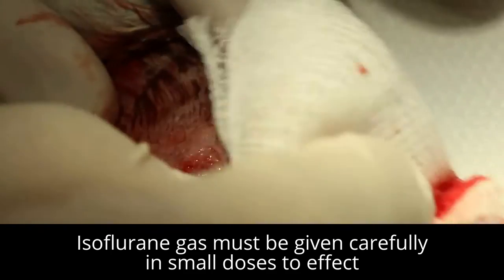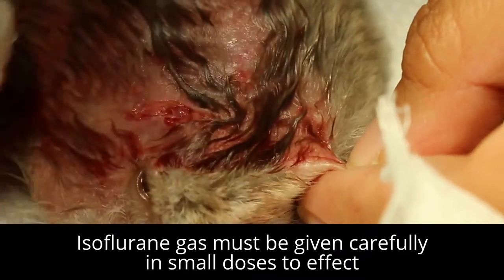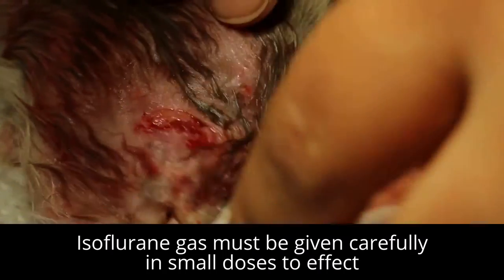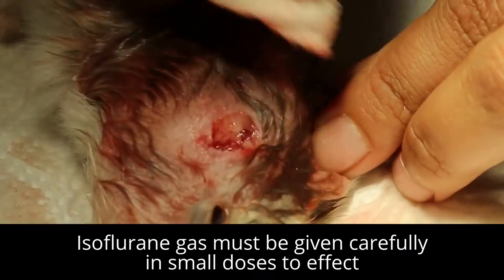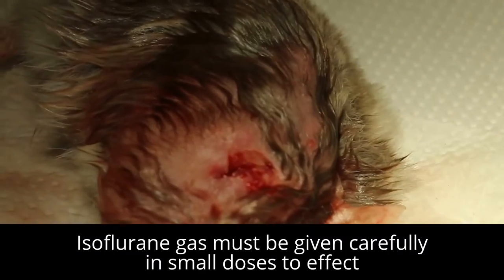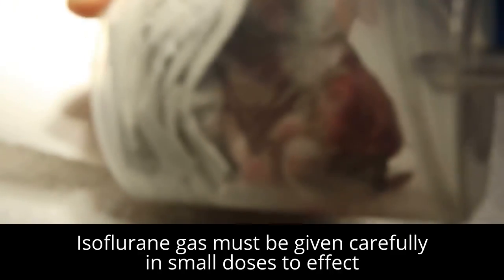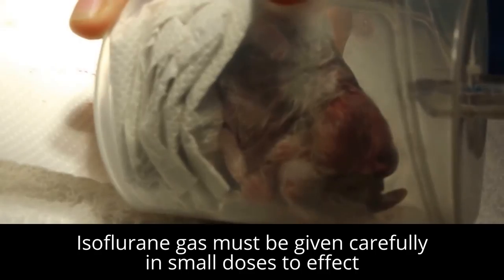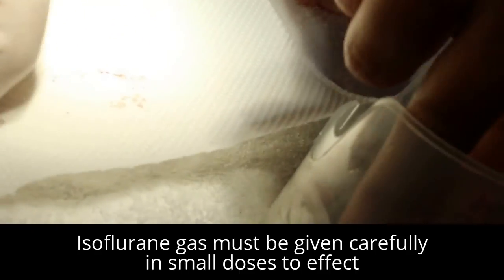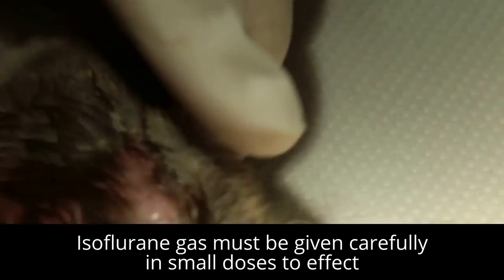Okay, so there's an opening here, so I have to stitch up. Okay, so it's 4-0. I use a 4-0. Okay, put back again, it's gonna wake up again because we don't want the hamster to feel the pain. So it's on and off. Count up to 10. 1, 2, 3, 4, 5, 6, 7, 8, 9, 10. Pick up. This 4-0 is a suture, absorbable. And position properly.